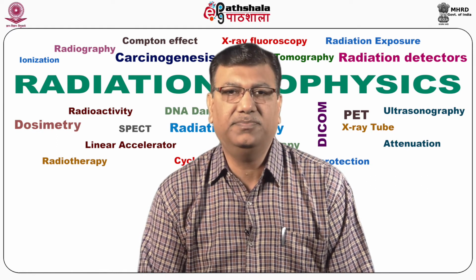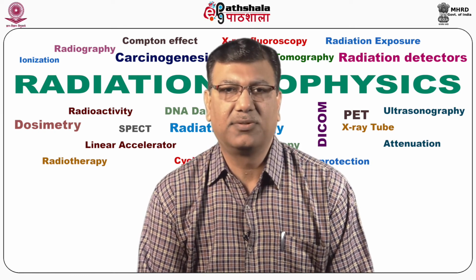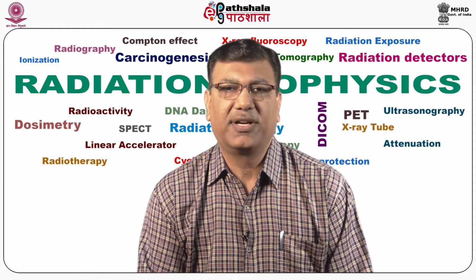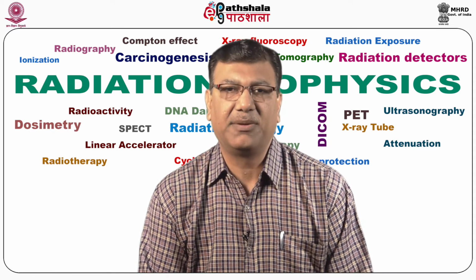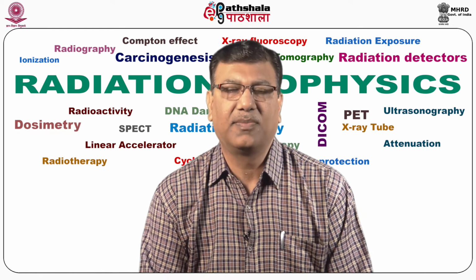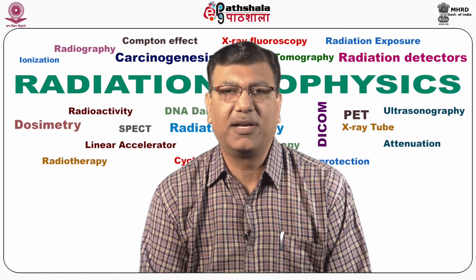Along with this teletherapy, the Cobalt 60 machine is also used, where a Cobalt 60 radioactive source emits 1.17 MeV and 1.33 MeV photons. The average energy is 1.25 MeV. But there are certain limitations of the Cobalt machine.